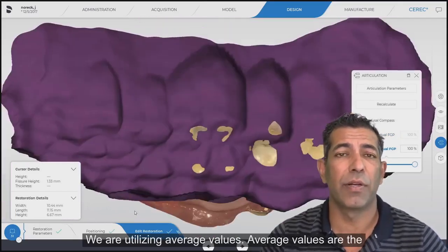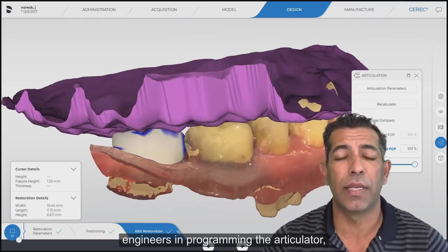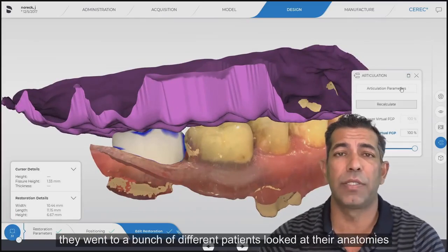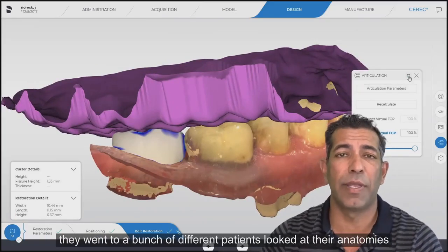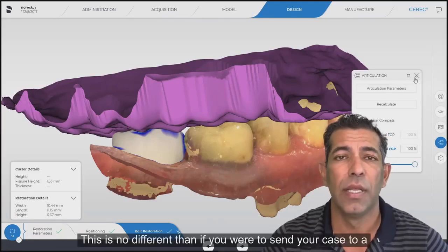Average values come from the engineers who programmed the articulator. They went to a bunch of different patients, looked at their anatomy, and said this is the average of all of these patients.